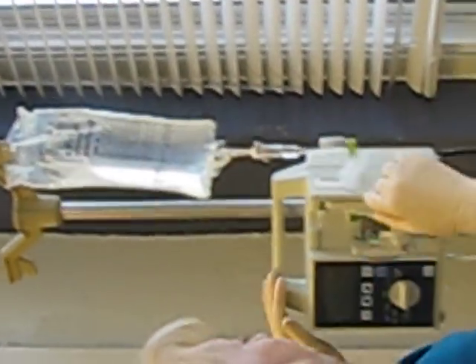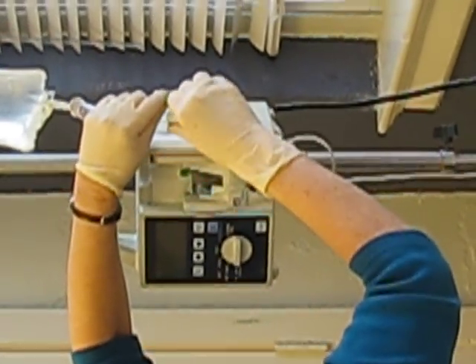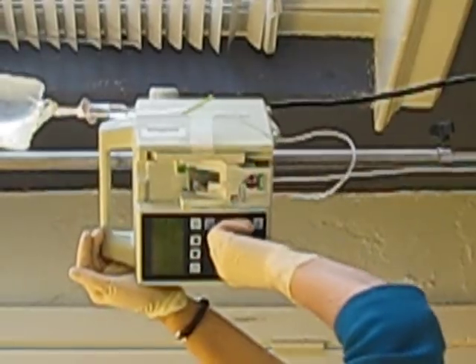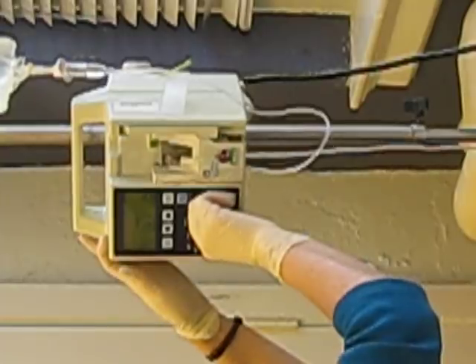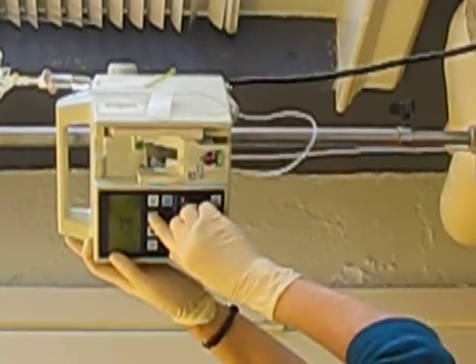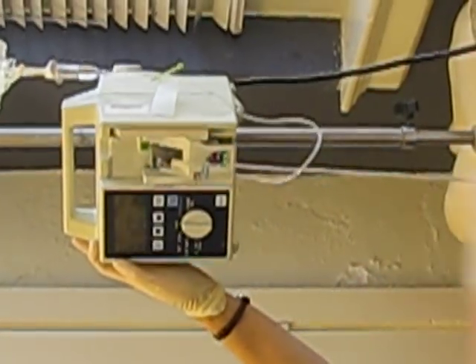And reset your machine. Open your clamp. Set the rate again on a primary line. Primary line — 950 volume to be infused. And we run it.